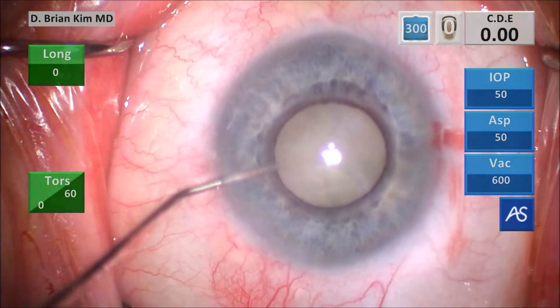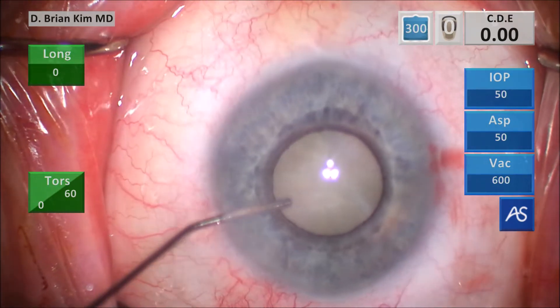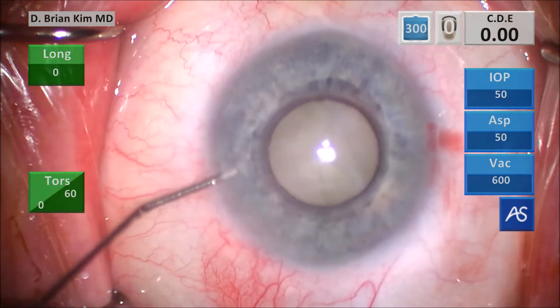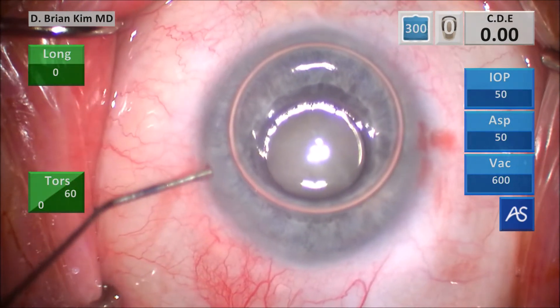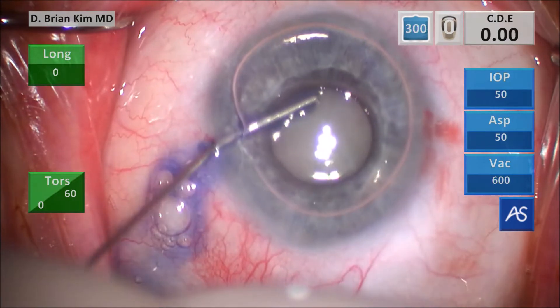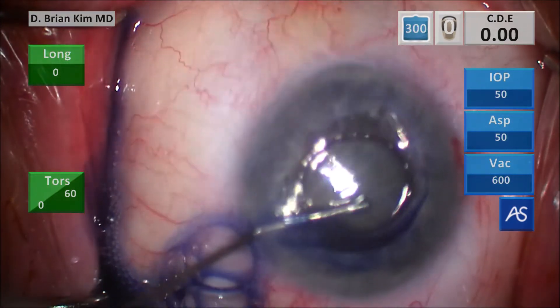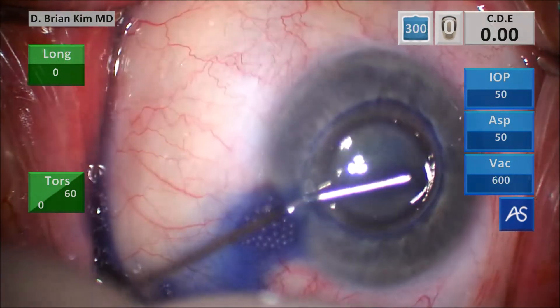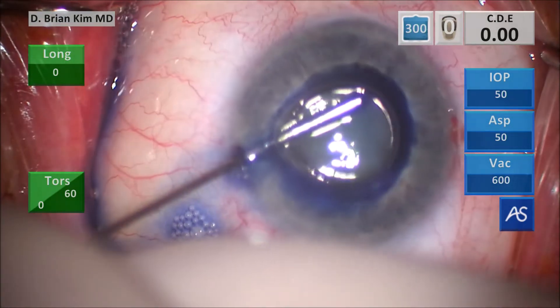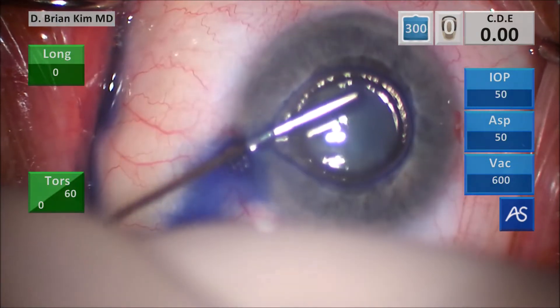This is intracameral epinephrine to stabilize the pupil. I pull the plunger back and then inject some intracameral air. This is trypan blue — I'm going to paint the anterior capsule surface with it. I don't over-inflate with the trypan blue; there's no reason to put that blue into the vitreous space and expose the retina to that dye. I'm using the cannula like a paint roller to paint over the anterior capsule.